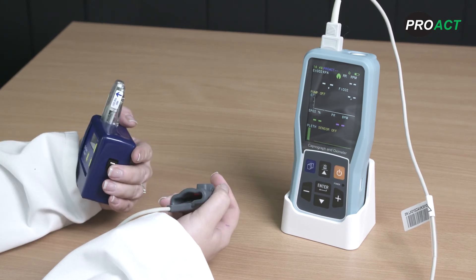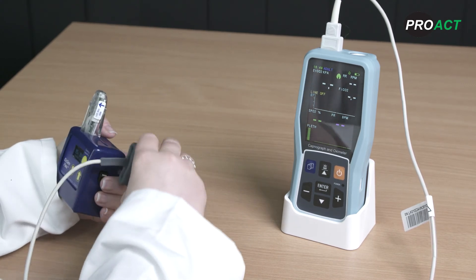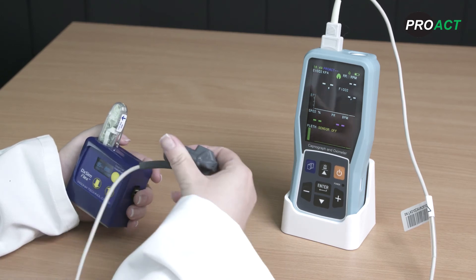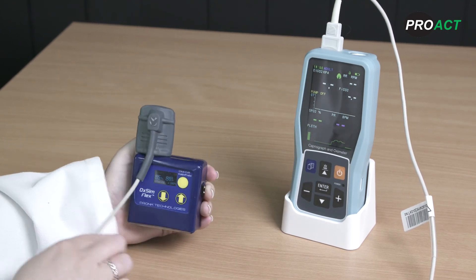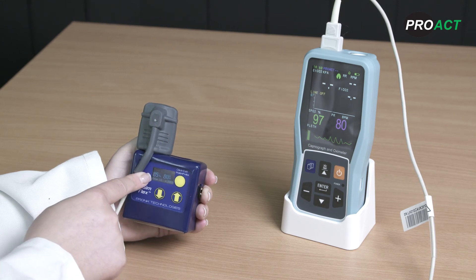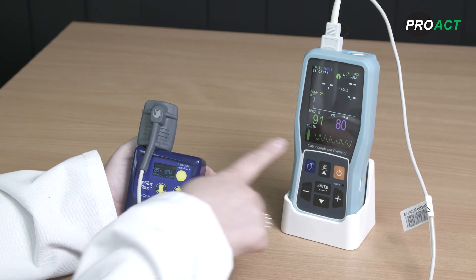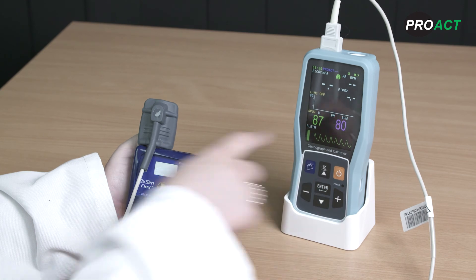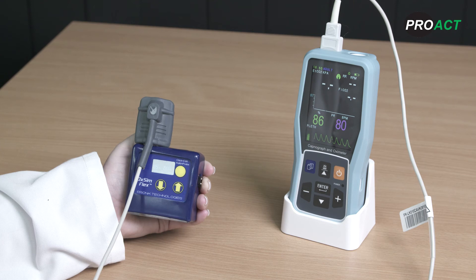Make sure the LED light in your pulse oximetry sensor is facing the side with the arrow marker on your patient simulator probe. Use the adjustment arrows on your patient simulator to adjust the simulation settings. Our patient simulator is set to give 85% SpO2 and 80 beats per minute heart rate, and the PC-900B is showing readings of 86% SpO2 and 80 beats per minute, which are both within the accuracy requirements of plus or minus two.